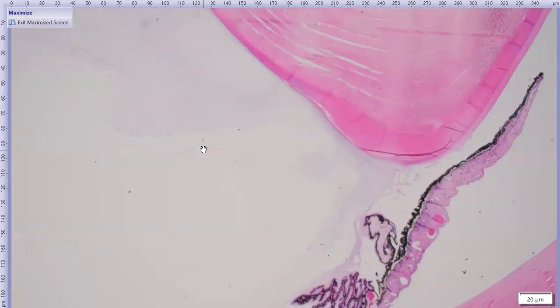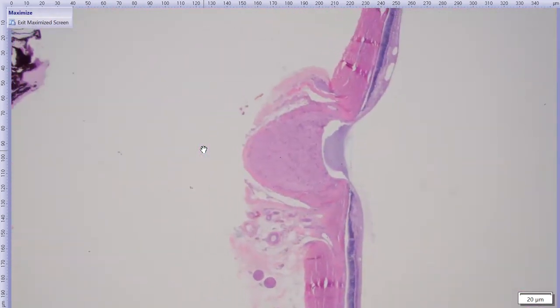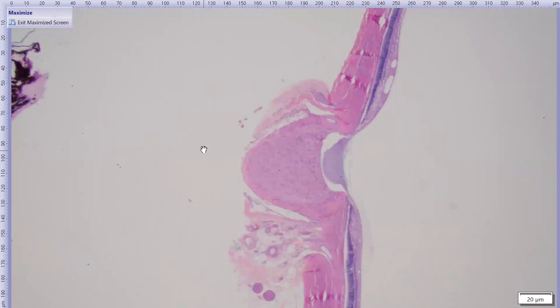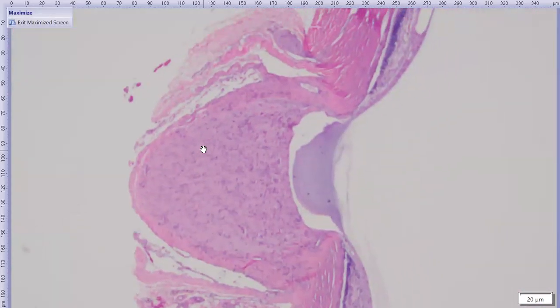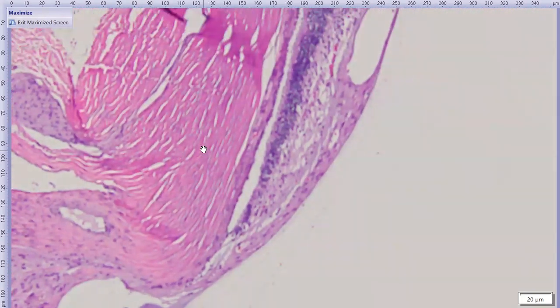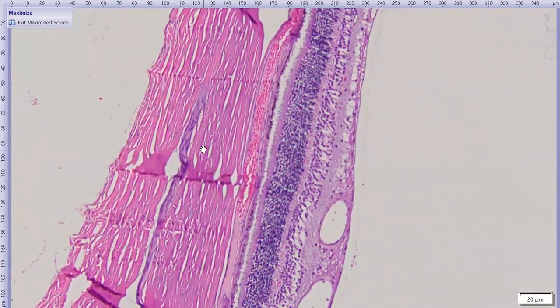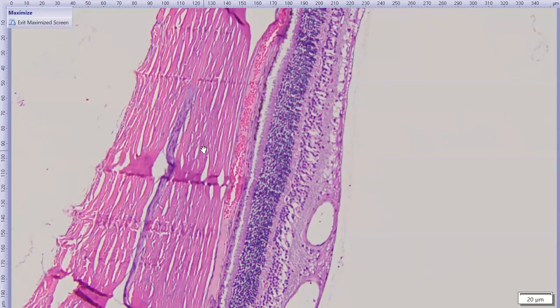So I'm going to skip over the elephant in the room briefly and just confirm for you another thing. This cat does have glaucoma, as they said clinically. We can see that cupping even from way back here. So here's a closer view, however, of that cupped optic nerve. And then cats tend to maintain their retinal architecture a little bit better with glaucoma. So you can still make out the nice, neat layers.